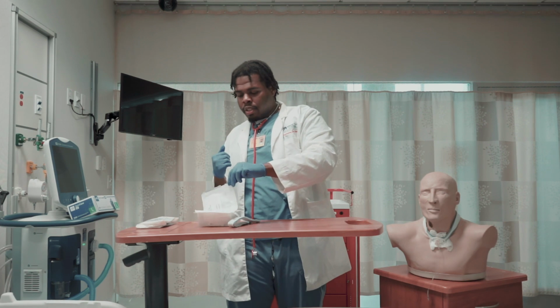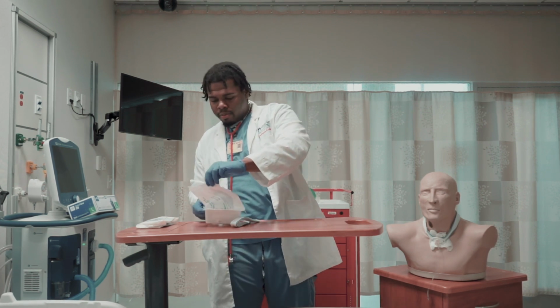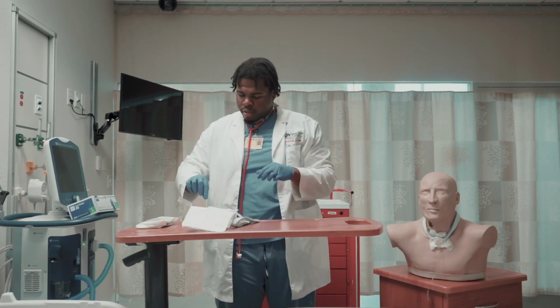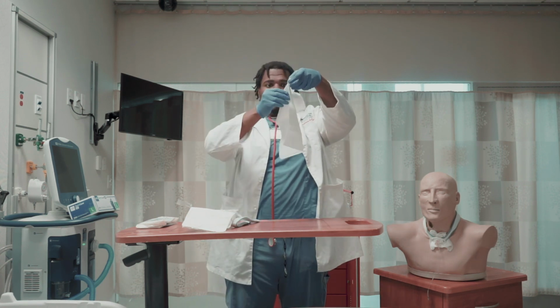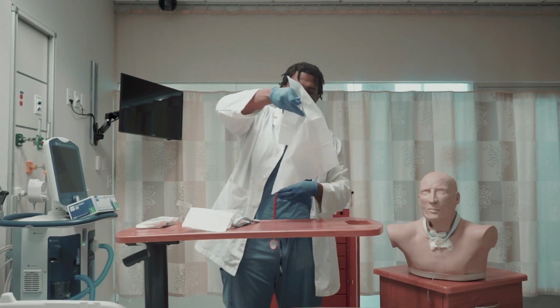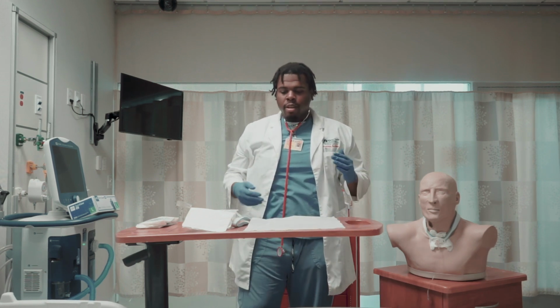So now I'm going to set up my field. Just my mat for now. Remember, the side that you touch is the side that has to face down because this is a sterile procedure. You could pinch the bottom, lay it flat on the table.